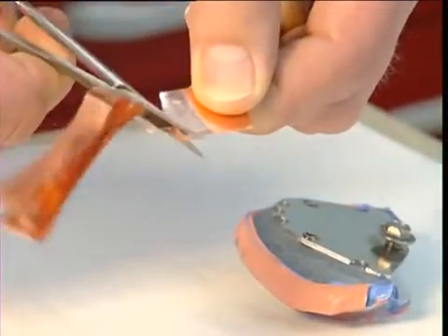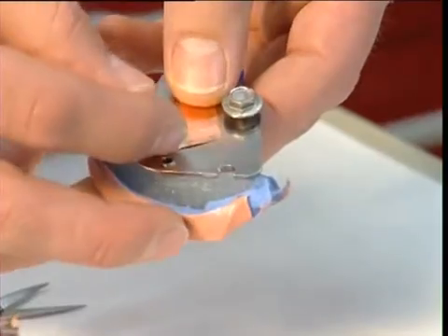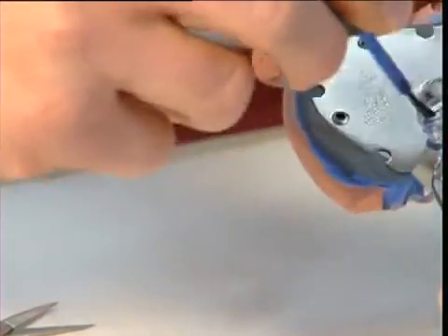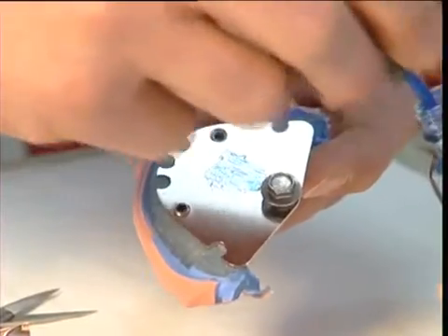The lower tracing plate is then prepared extraorally for the Gothic arch registration. The copper foil is cut to size. A thin coat of silicone adhesive applied to the tracing plate and the copper tracing foil adhered into place.